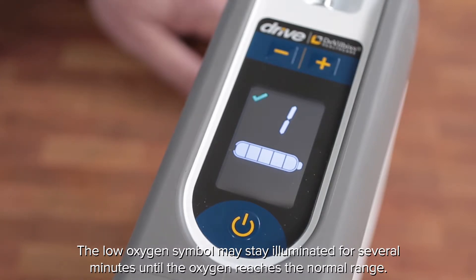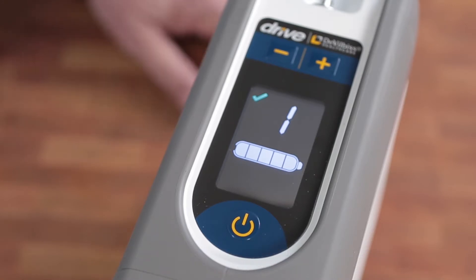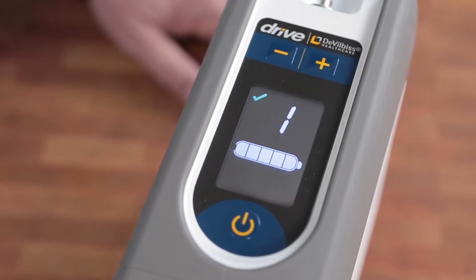The low oxygen symbol will stay illuminated until oxygen is in normal range, after which a green normal oxygen symbol illuminates.